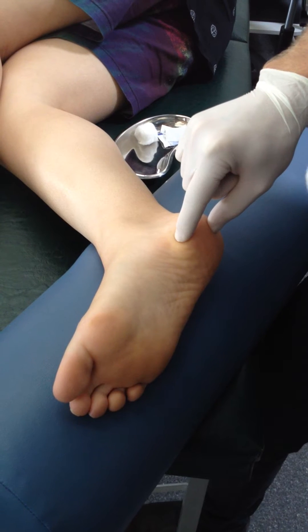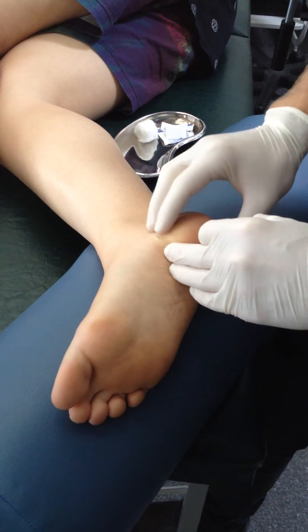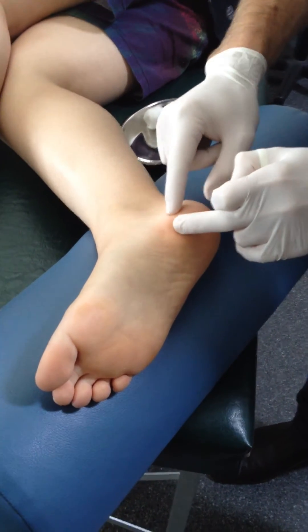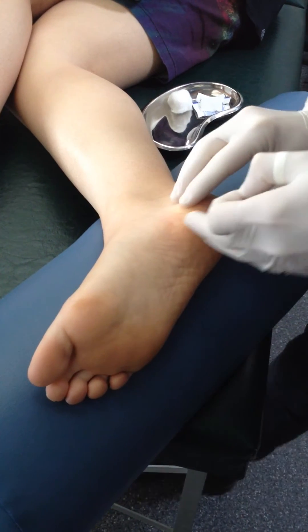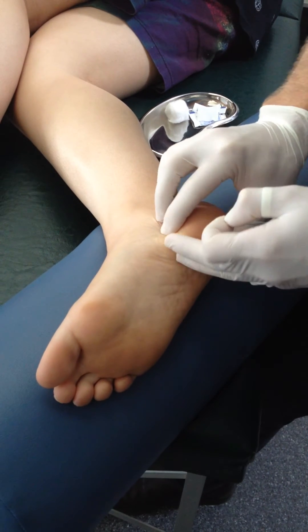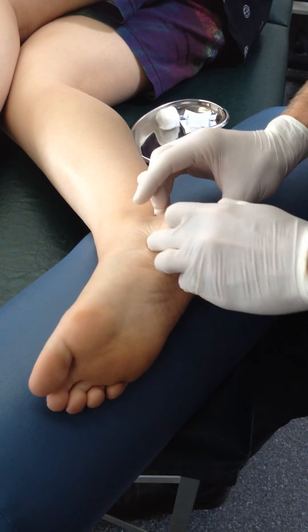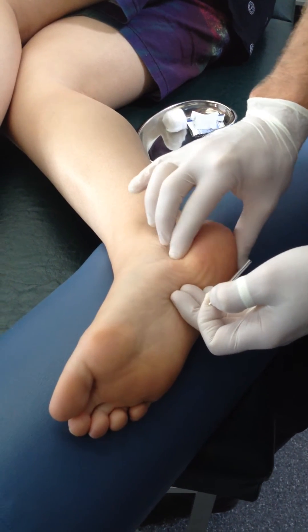How aggressive you are with your needling is a real consideration. The more you can start off the plantar surface — away from that heel pad — the less sensitive it tends to be, as the skin is less thick there. You can generally start a little bit above it, but accuracy with this is really important. There's a trigger point right there, and these can be quite painful.